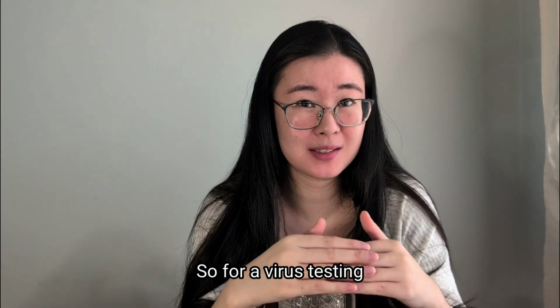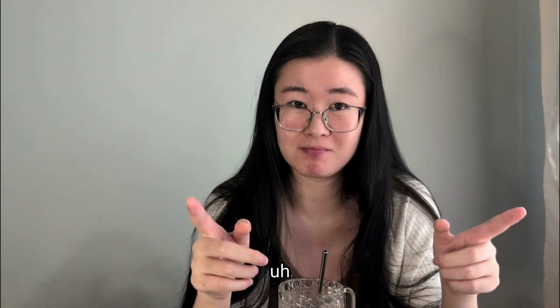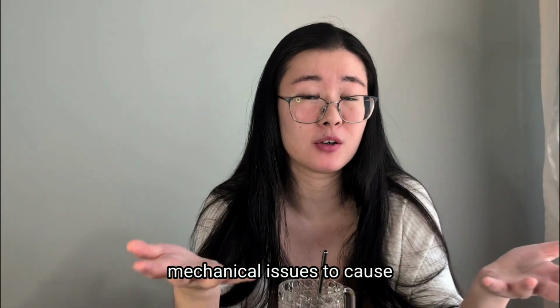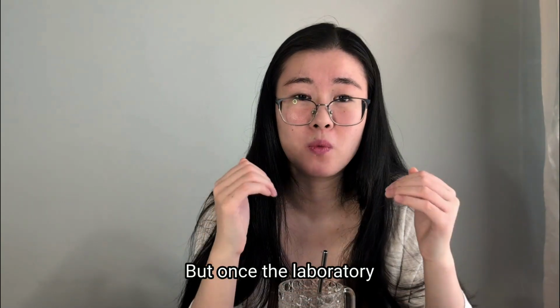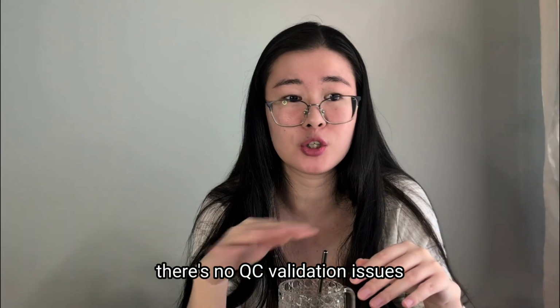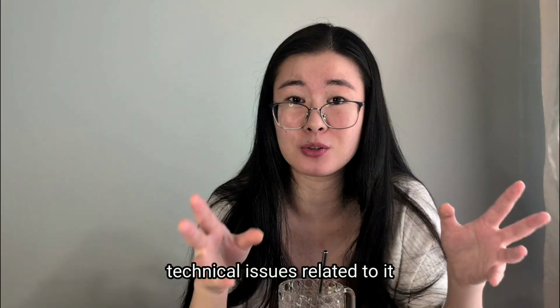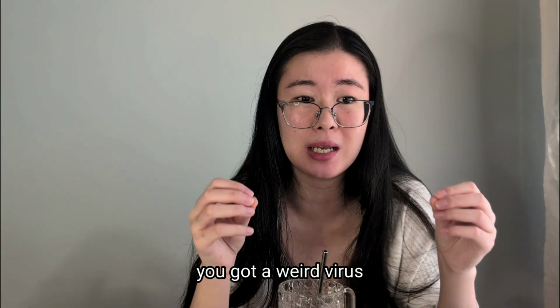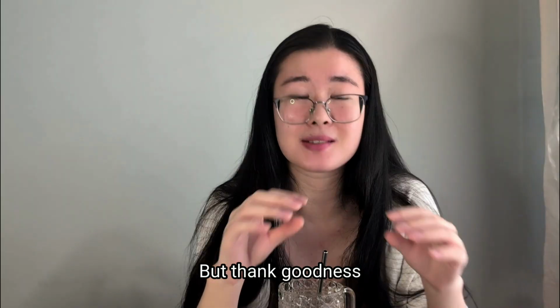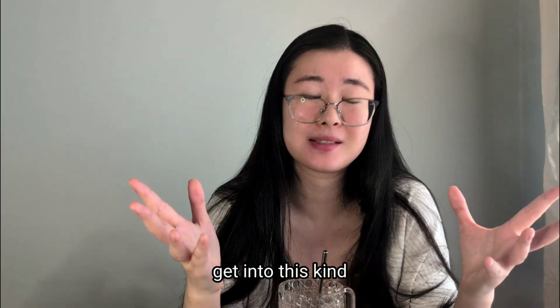So for virus testing, if you don't have a definite result within half a day, make a call. Of course, first make a call to the bench. Maybe there is some mechanical issue causing this. But once the laboratory bench tells you there are no mechanical issues, no QC validation issues, no technical issues related to it, and it's purely that you got a weird virus, that's the time you probably want to call the pathologist. But thank goodness, this is very rare. So let's hope you never get into this kind of situation.